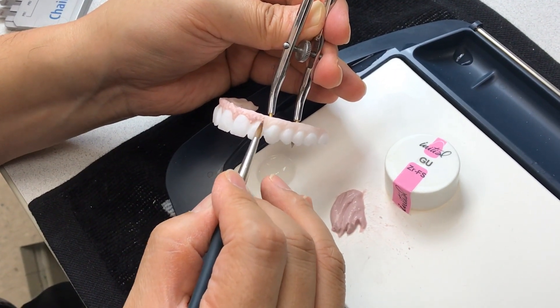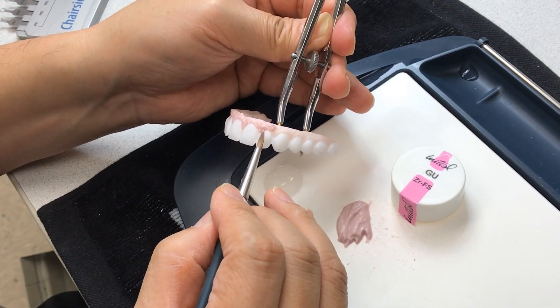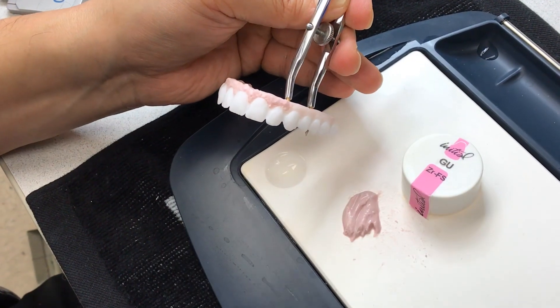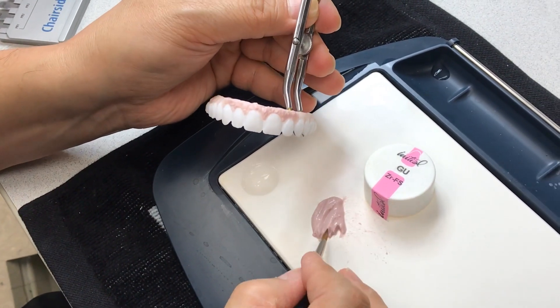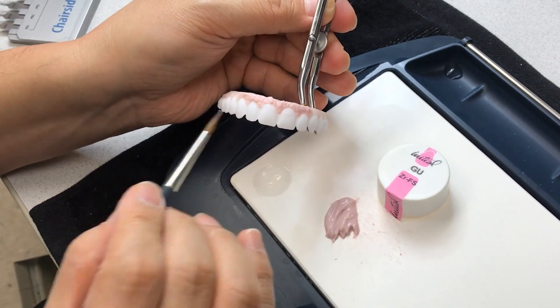I have to set the central, then move to lateral. This good part is this is live — meaning live cases.